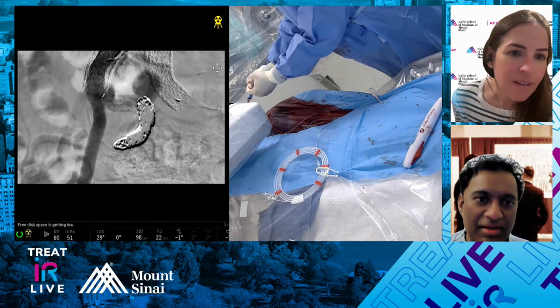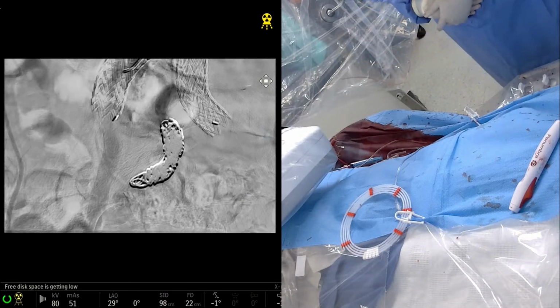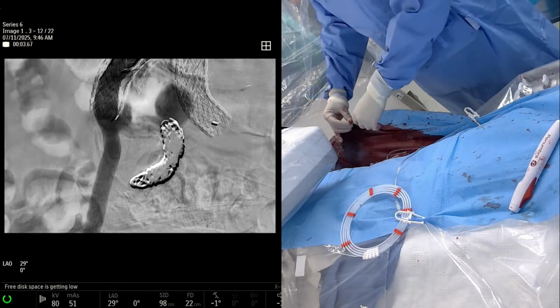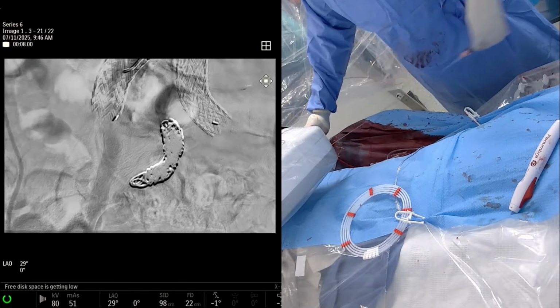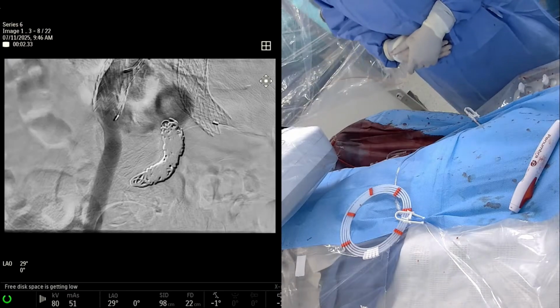Wow, that's pretty good. That's very good. Looks great. I like that. I feel like your technique of putting the O3O and then the O2, I don't even know the diameter, but the intermediate coils now, in there, to fill up the rest of the space. All right, so we just took that out.